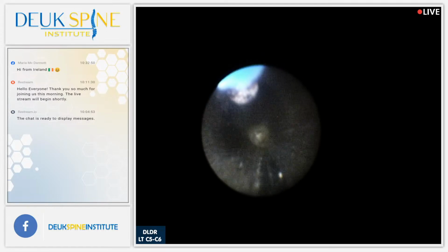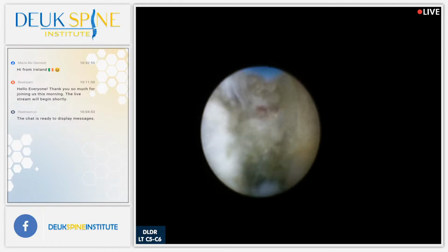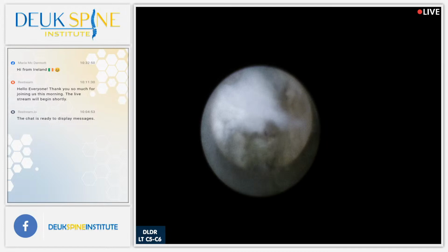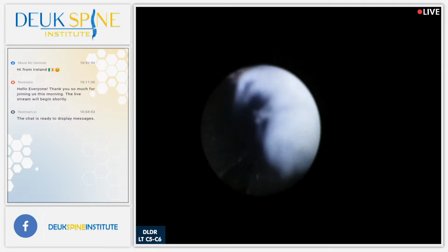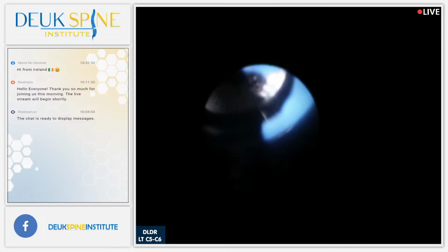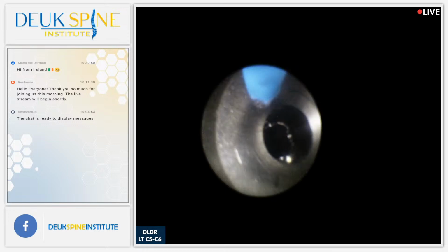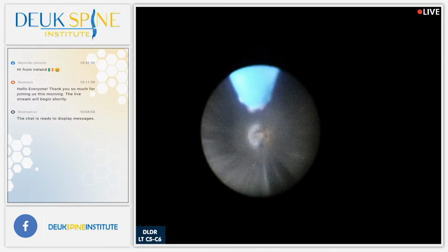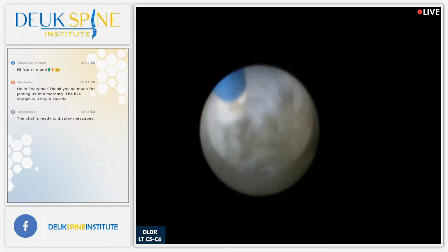This patient came from Canada. Where in Canada is he from? How are we doing on the irrigation? Yeah, I would keep it going for a minute because I got to float out a couple of pieces here. Where is he from in Canada? Toronto? Is it Ontario? All right.